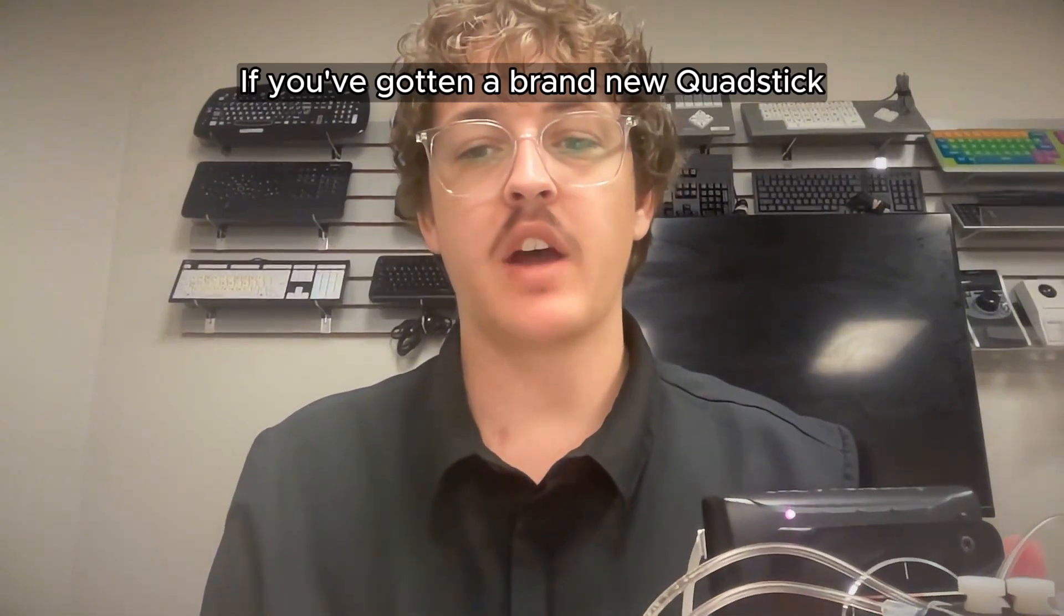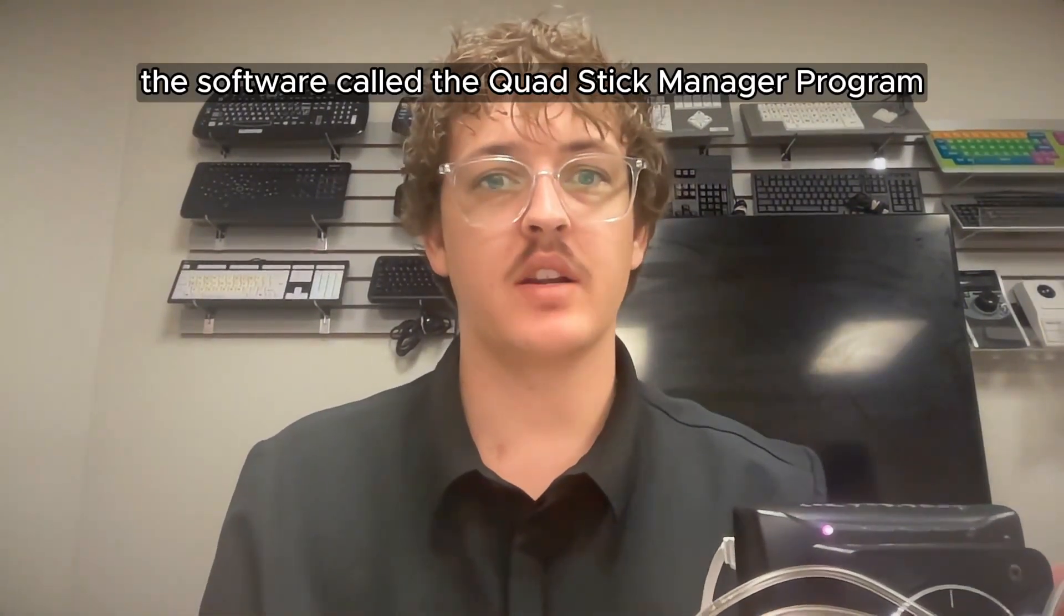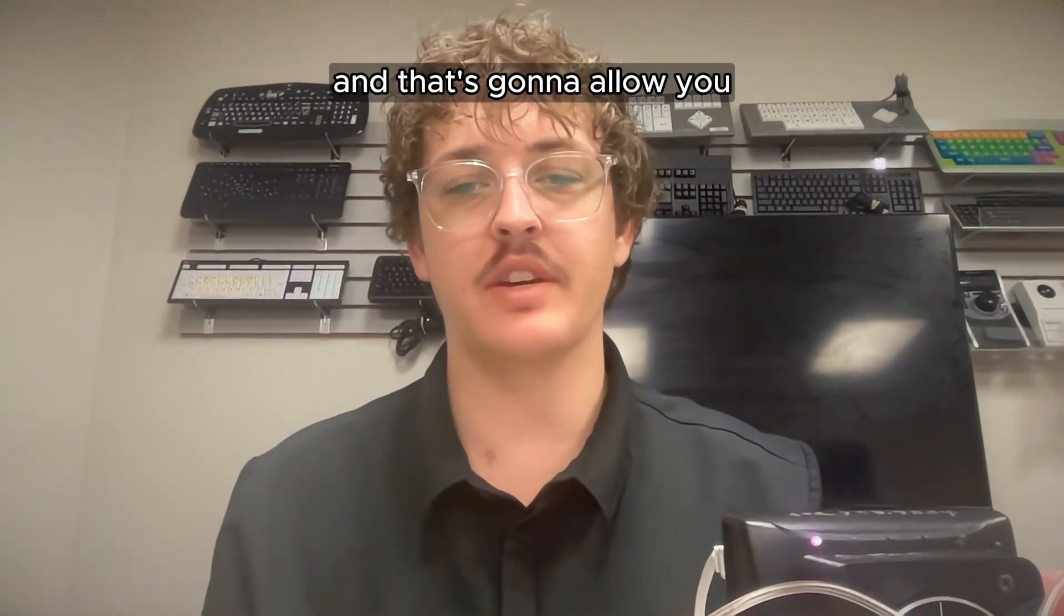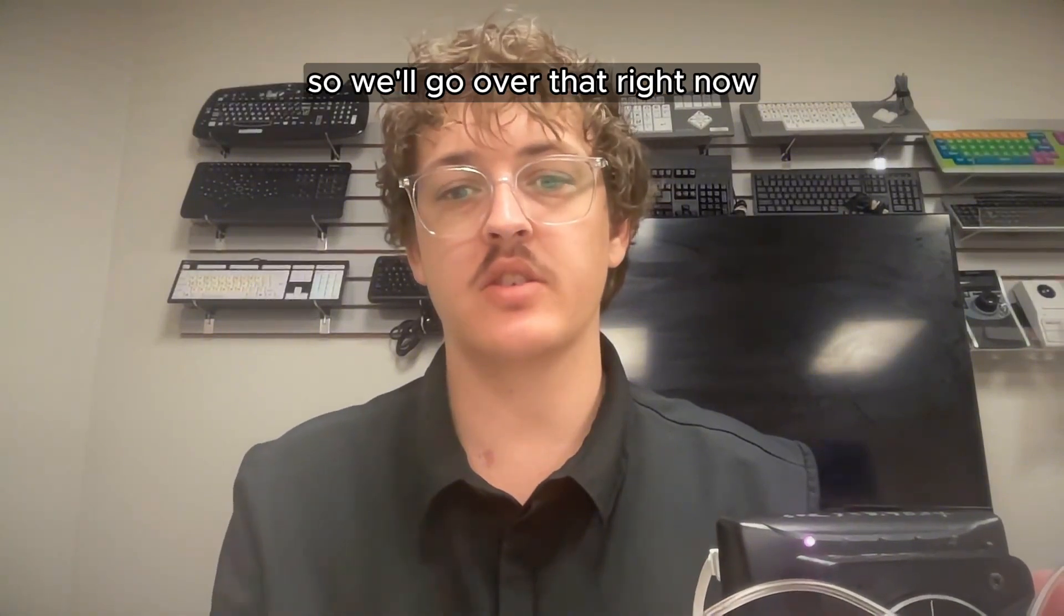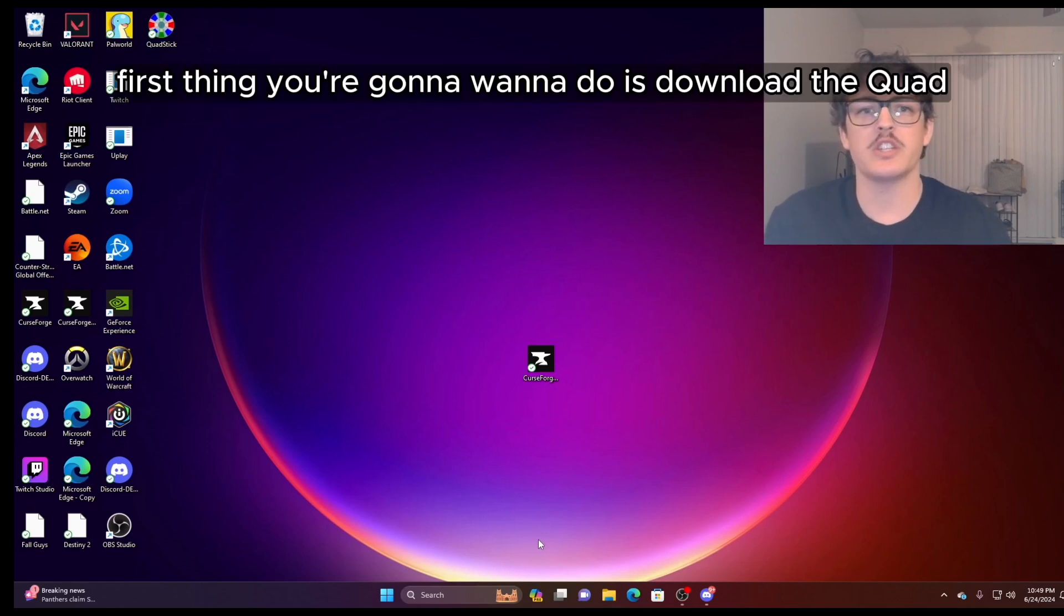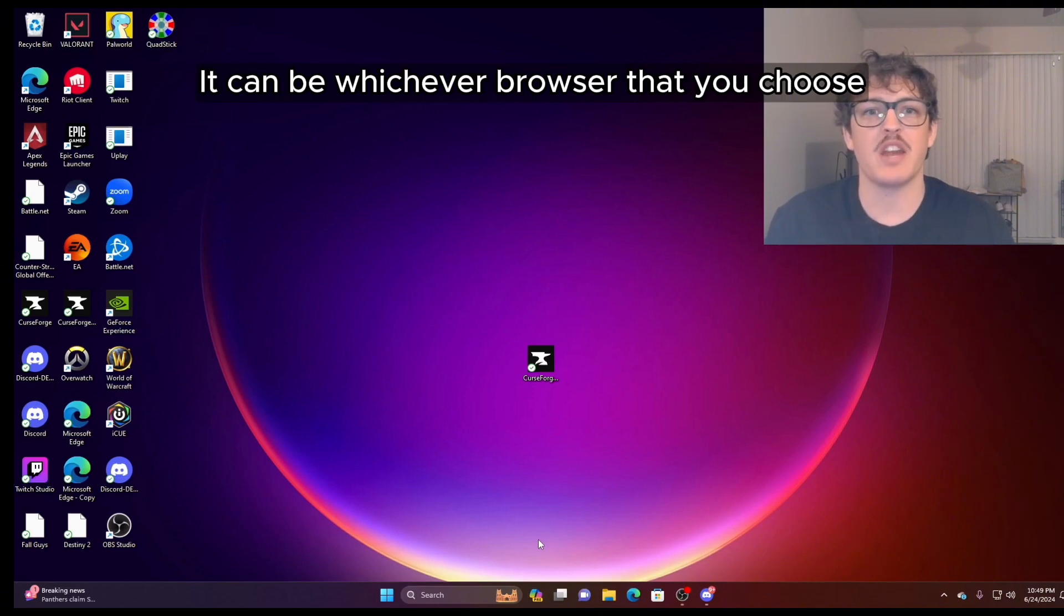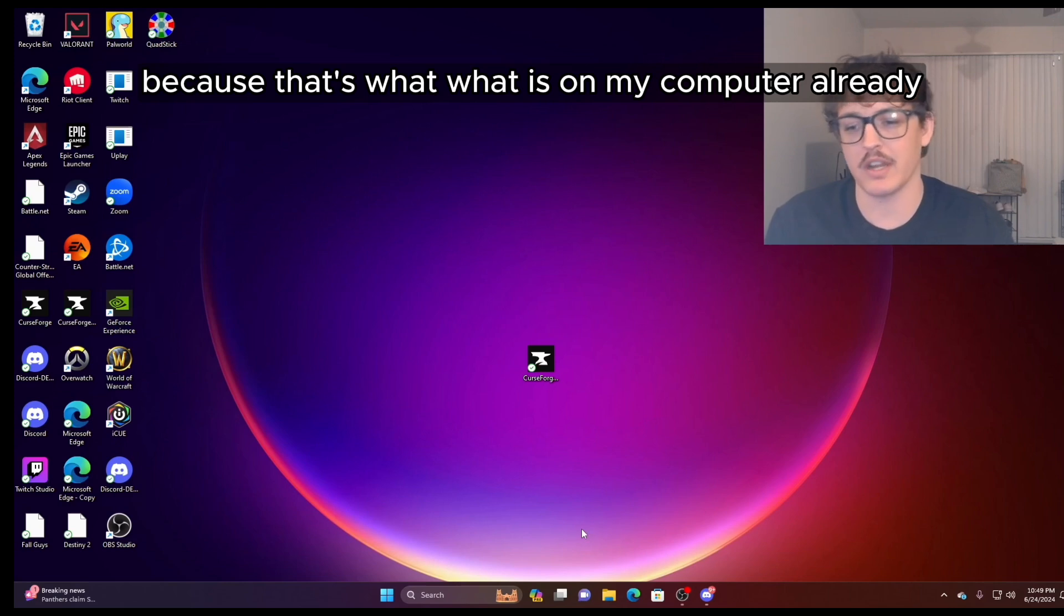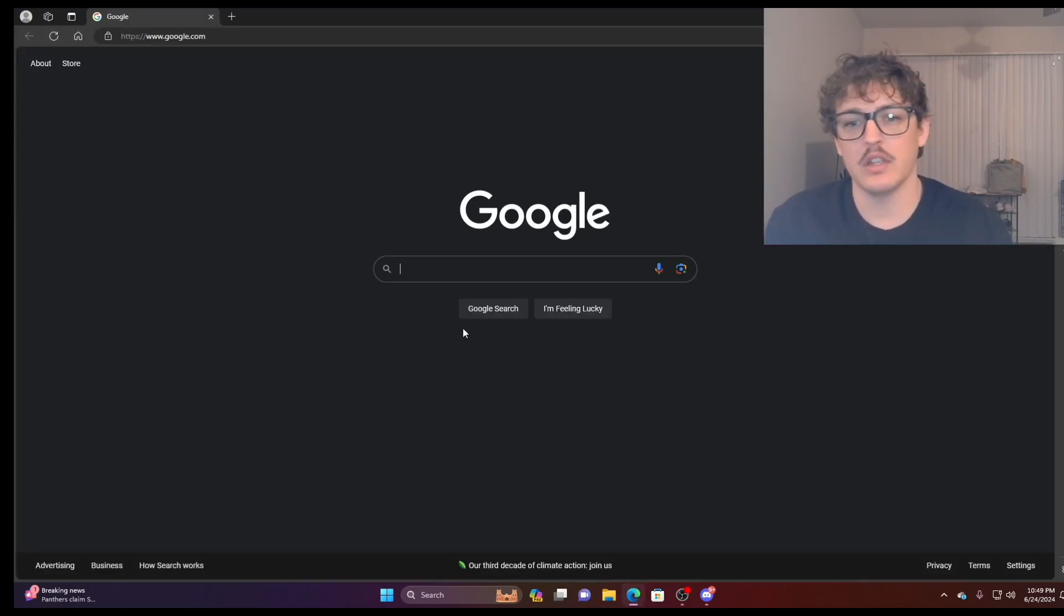If you've gotten a brand new QuadStick, first what you're going to need to do is download the software called the QuadStick manager program. And that's going to allow you to customize a bunch of different things in the QuadStick. So we'll go over that right now. If you've just gotten your new QuadStick, first thing you're going to want to do is download the QuadStick manager program. First, you're going to open up your internet browser, it can be whichever browser that you choose, but I'm using Microsoft Edge because that's what is on my computer already.